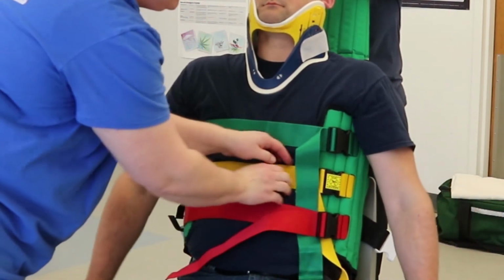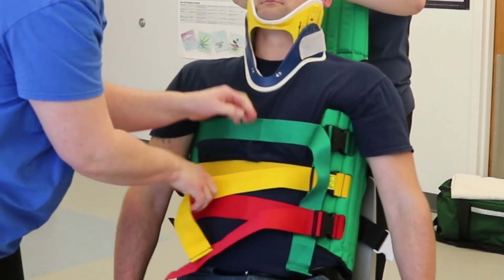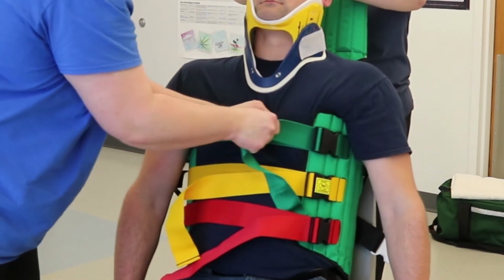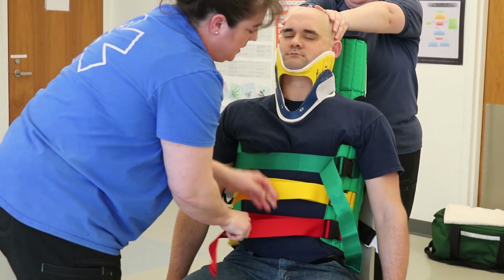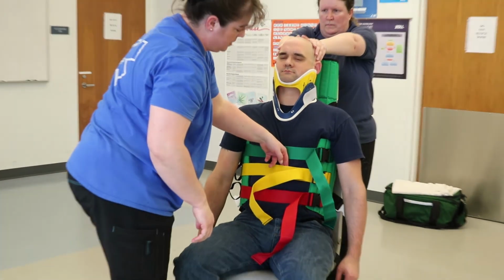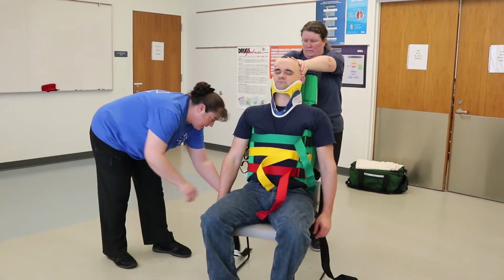And now I will tighten the torso. Could you take a deep breath and let it out? Deep breath, let it out, and a deep breath and let it out. And I'll check to make sure that we are not constricting the chest. I'm now going to secure the hips.